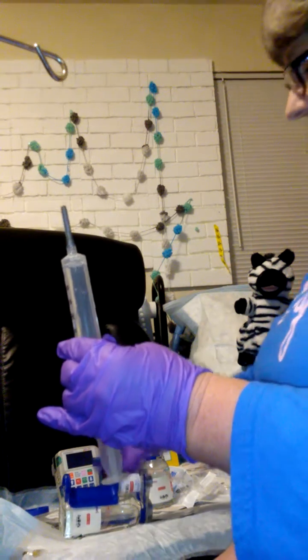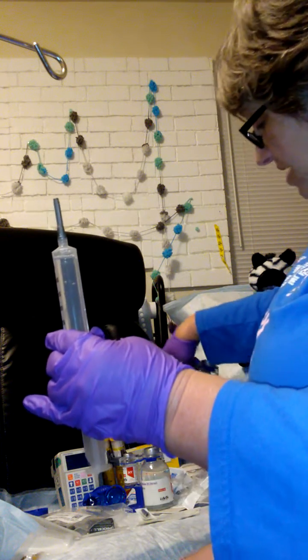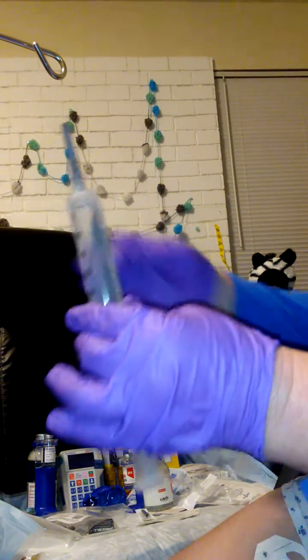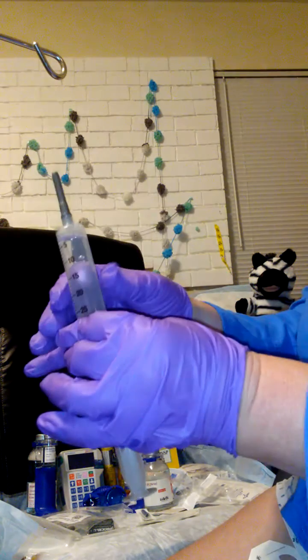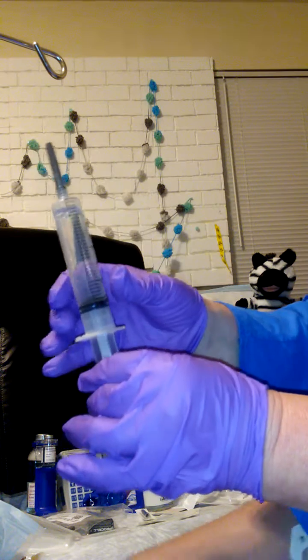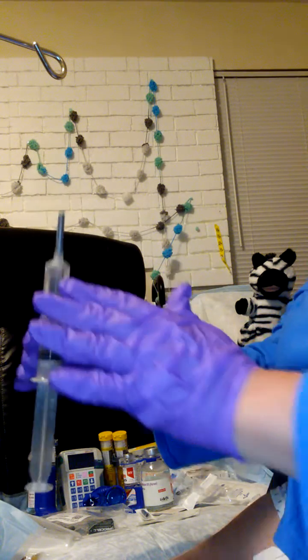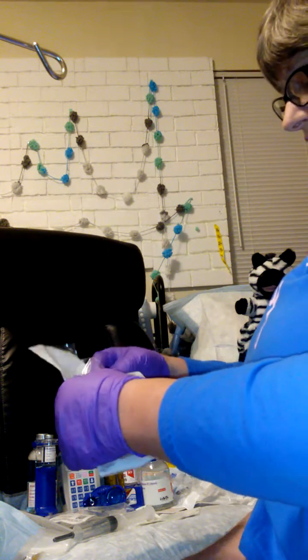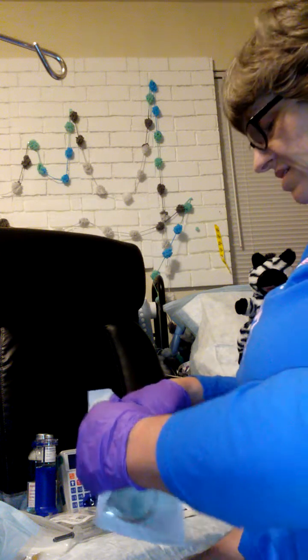Okay. I'm going to try to get this to sit up straight because we don't want to get any aggravated air bubbles in there. So this is ready to be attached to the needles. The needles don't go into my skin yet, but we got this ready. I'm going to lay it down. I usually do this at my kitchen table. I have more space, or downstairs in my living room.